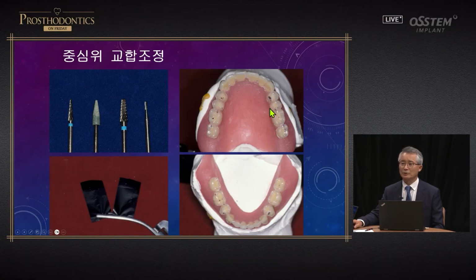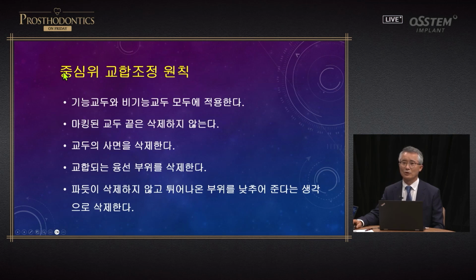If you use it, in the upper and lower, you can see there's barely any occlusion. You should not get stressed, and you can just start with occlusal adjustment.